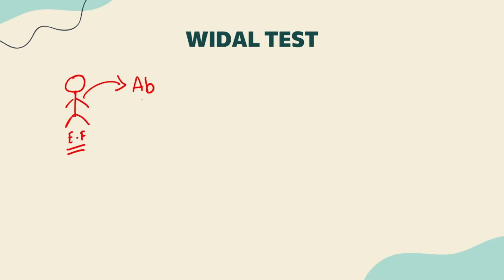Now these antibodies would be present in the serum of the patient, right? And in order to do the Widal test we require various antigens. On the previous slide I mentioned, so यहाँ पे it's a tube agglutination test, yes or no?